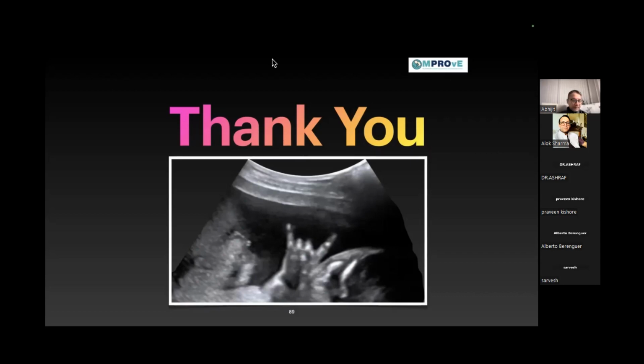Yes. So Asian has asked a question. Will you see the seashore sign on a B profile if there's pleural sliding? Answer is yes, absolutely. So any lung pathology, I'll give you an extension of that further.